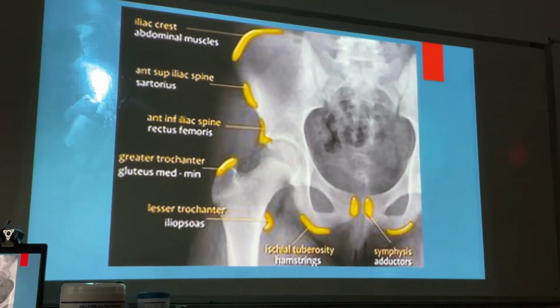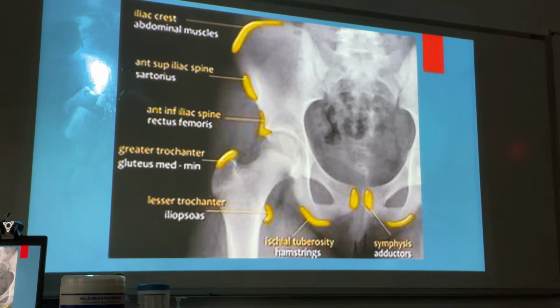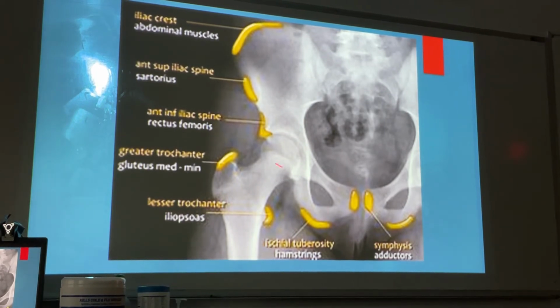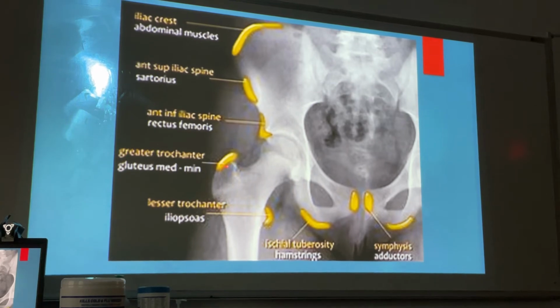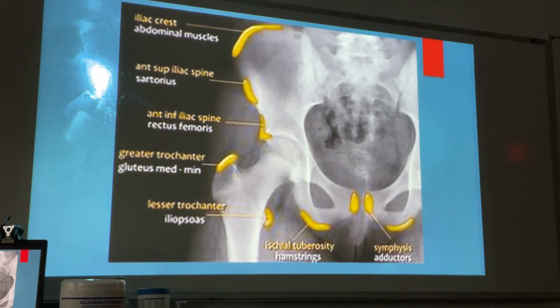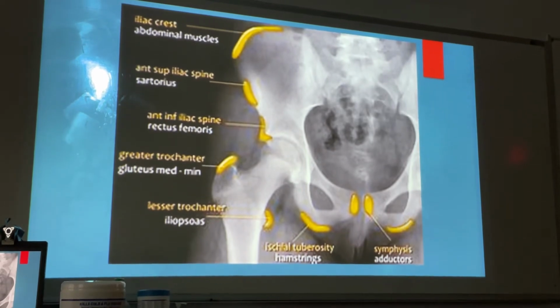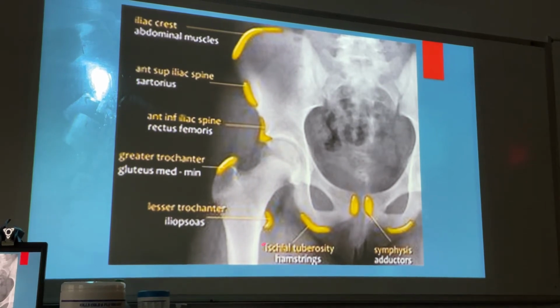This will come, we can incorporate it today, because if we have a sudden contractile muscle activity, okay, I can avulse here, which is hip. I can also have avulsion of the greater trochanter, or whatever the tendon is that attaches here can repetitively pull, and then this greater trochanter becomes malformed. That's part of your hip evaluation. Not malformed, has degenerative changes at the tendon periosteal junction. Okay? The thing to point out today is when you do a nice hip examination, you're able to see the lesser trochanter.